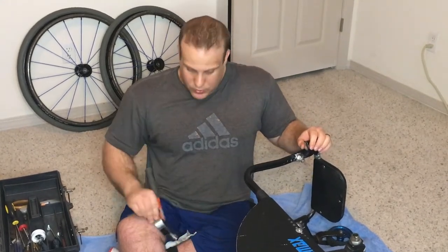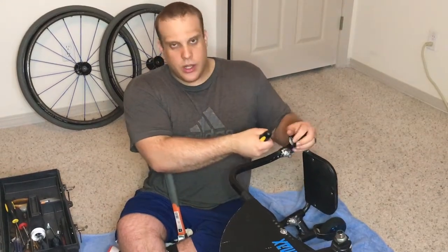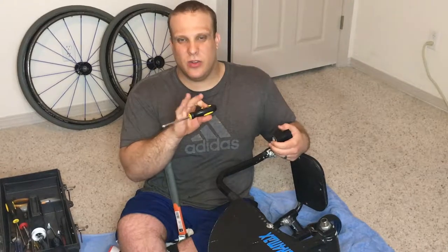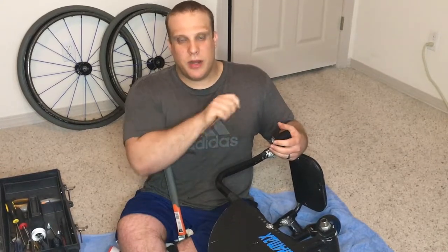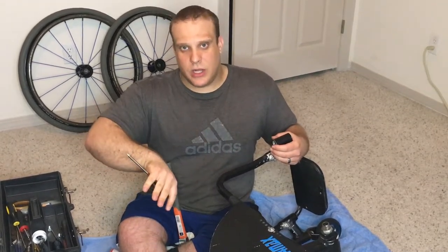If they're really stubborn and you can't get them out, one trick of the trade is to take a hair dryer, turn it on high, and hold it there for a couple of minutes. Or if you have a heat gun, just be careful because you don't want to get the metal too hot. Most of these chairs are aluminum, and if you heat it up, the aluminum expands and those bearings slide out a lot easier.